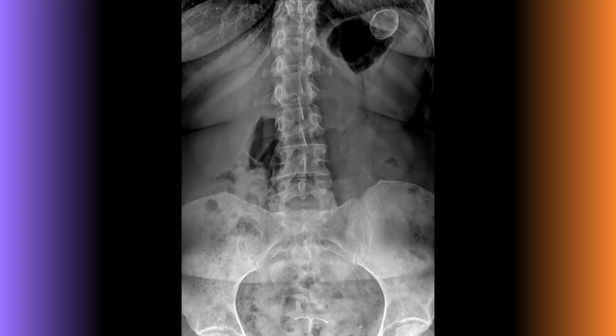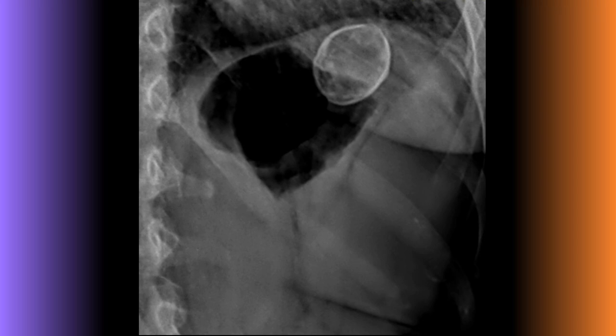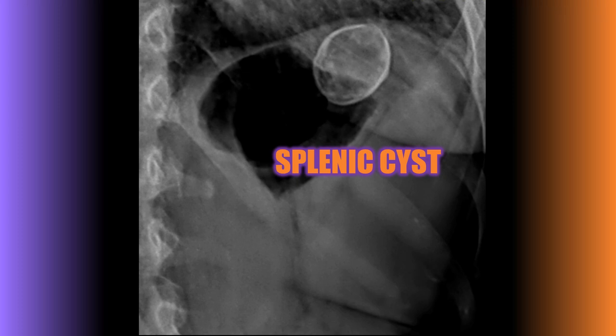On this frontal lumbar radiograph there is a cyst wall calcification in the left upper abdomen adjacent to the gastric air bubble. This is a good example of a calcified splenic cyst. Approximately 80% of all splenic cysts are secondary cysts, often post-traumatic in etiology, and typically ultrasonography or CT are the appropriate follow-up imaging.